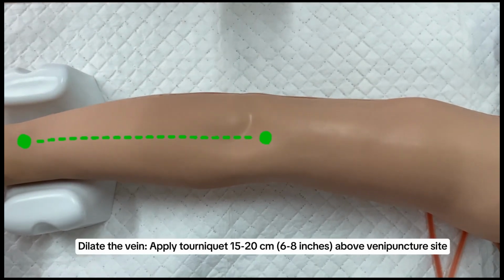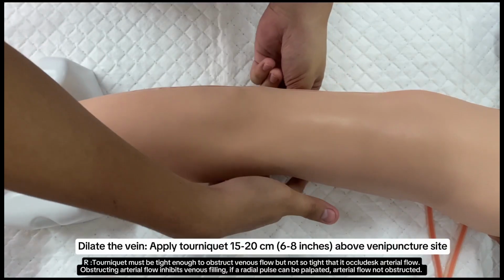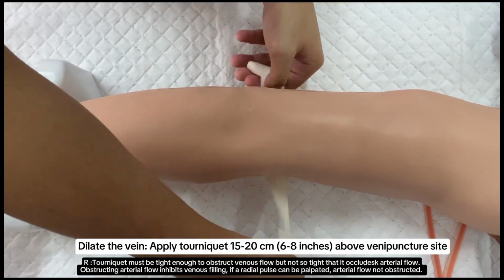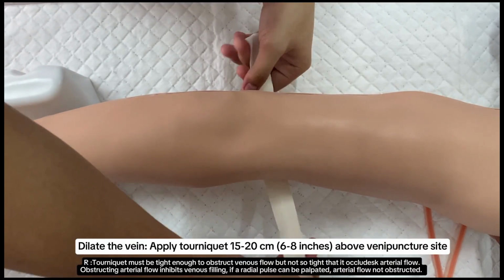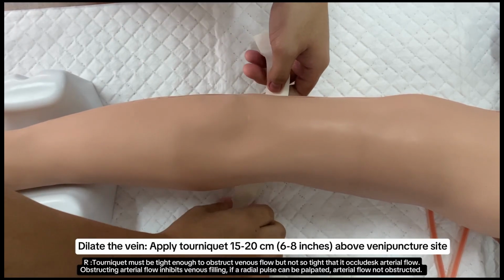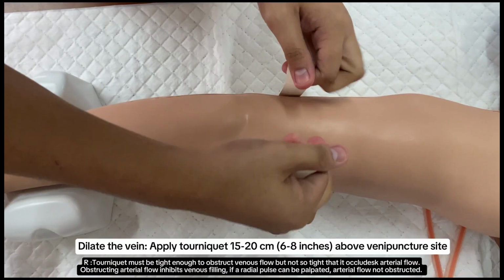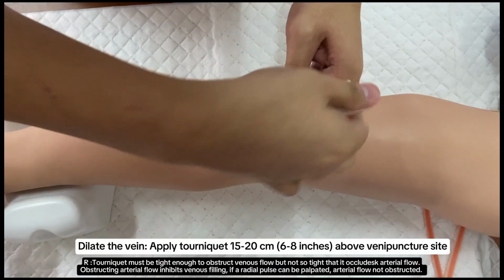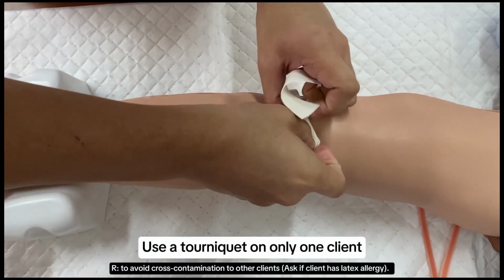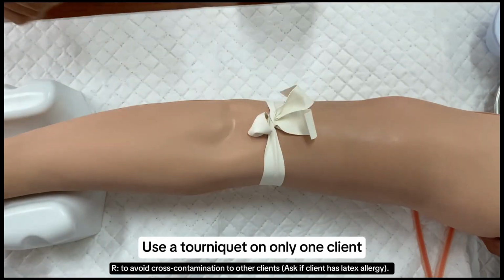When dilating the vein, apply a tourniquet 15 to 20 cm or 6 to 8 inches above the venipuncture site. The tourniquet must be tight enough to obstruct venous flow, but not so tight that it occludes arterial flow, because obstructing arterial flow inhibits venous filling. If a radial pulse can be palpated, arterial flow is not obstructed. Use a tourniquet on only one client to avoid cross-contamination with other clients. Also, ask the client if they have a latex allergy.